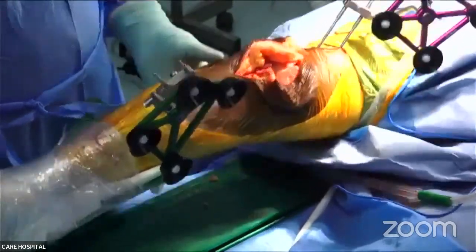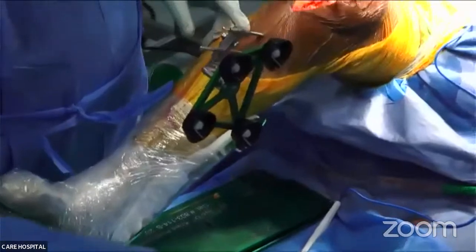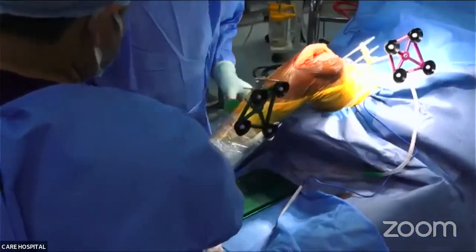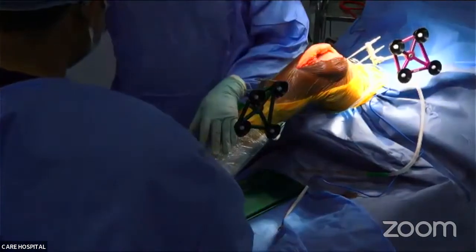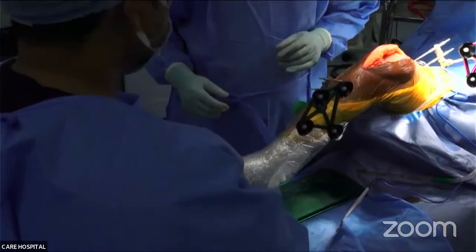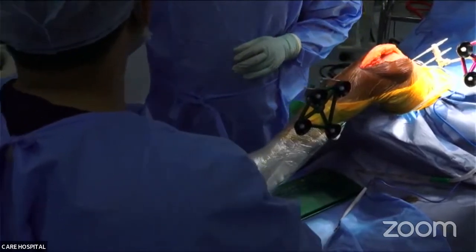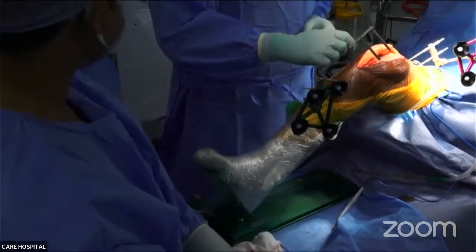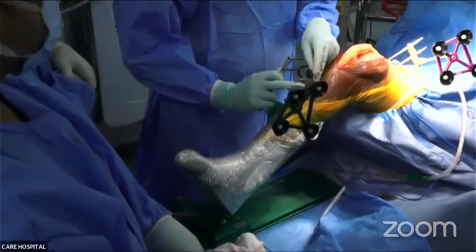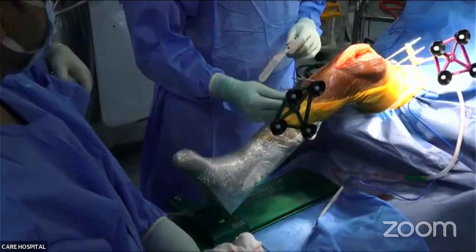So these are simple Schanz pins, and you can directly drill them into the bone. There is a jig there. Anmol, show me that. So you have got a jig, something like this, and you put these Schanz pins through the tracker, over which you can apply the tracker balls.